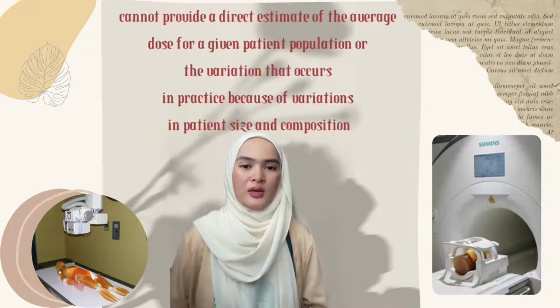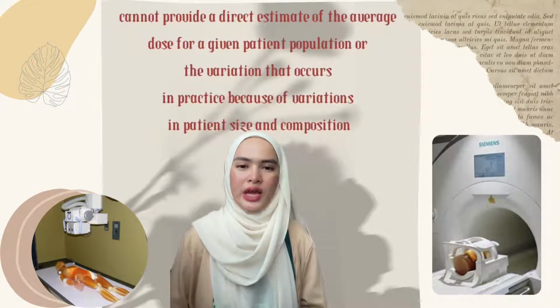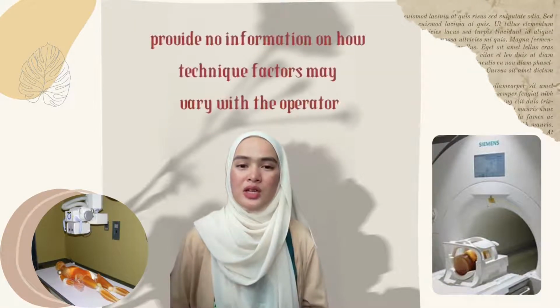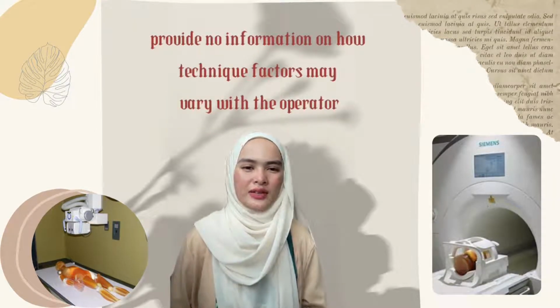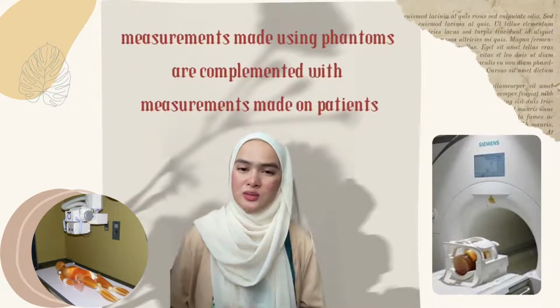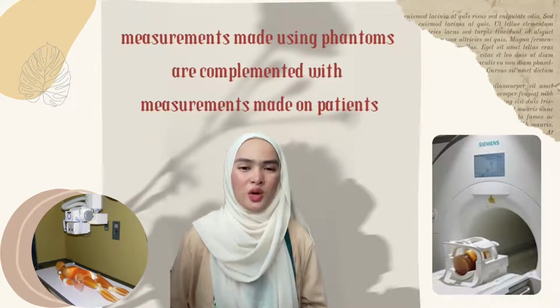However, they cannot provide a direct estimate of the average dose for a given patient population or the variation that occurs in practice because of variations in patient size and composition. They also provide no information on how technique factors may vary with the operator. It is important, therefore, that measurements made using phantoms are complemented with measurements made on patients, though the measurement frequency will be different for the two types of measurement.